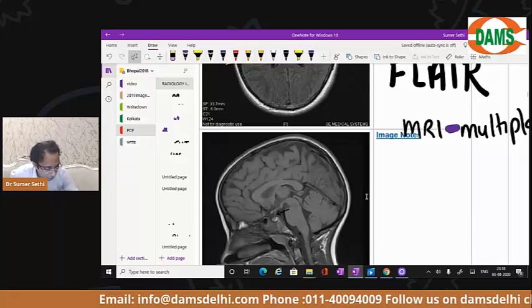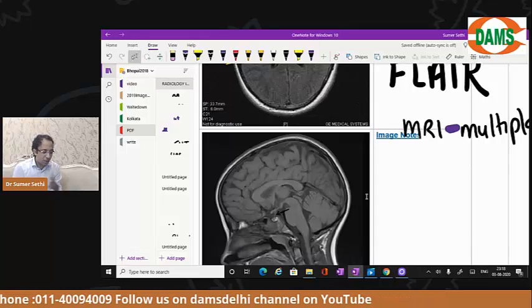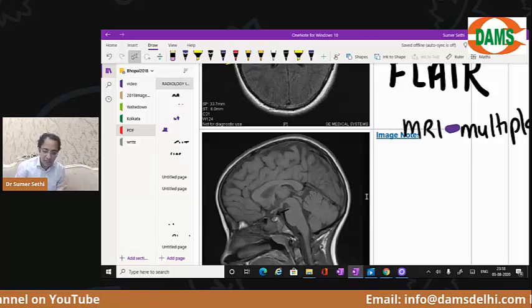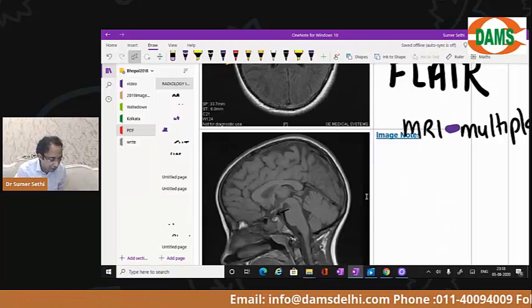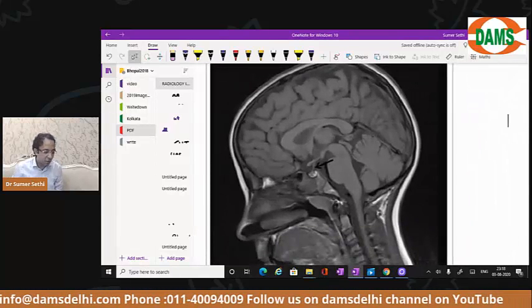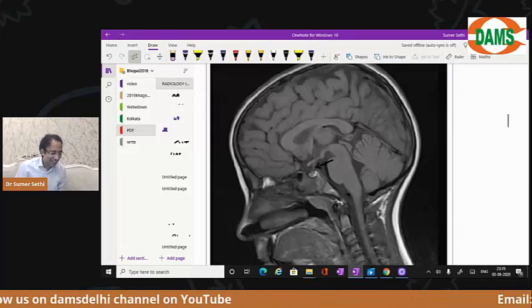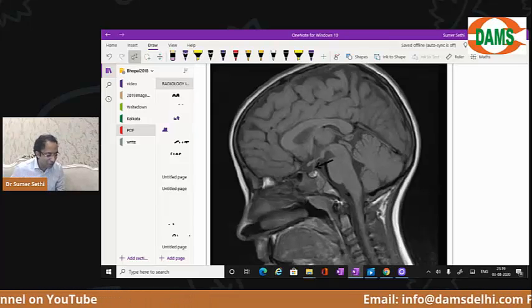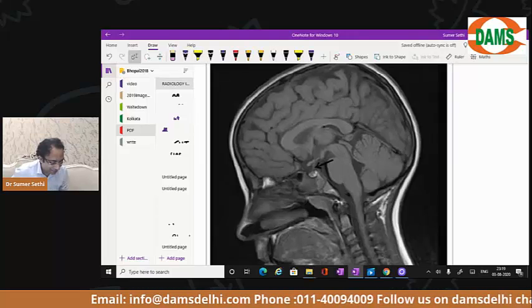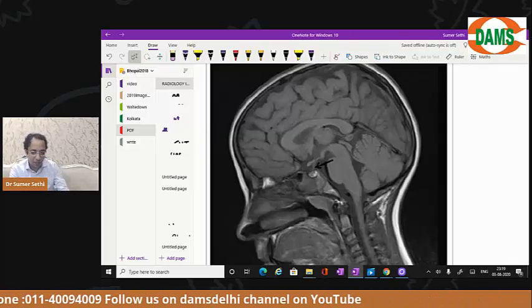So we got an idea of how the actual brain looks on a sagittal plane. Now, if I convert that sagittal section that we learned in anatomy and show it to you on MRI, I want everybody to come back. I actually took out my own brain to show you. Now let us come back. I see all of you are now back and excited.